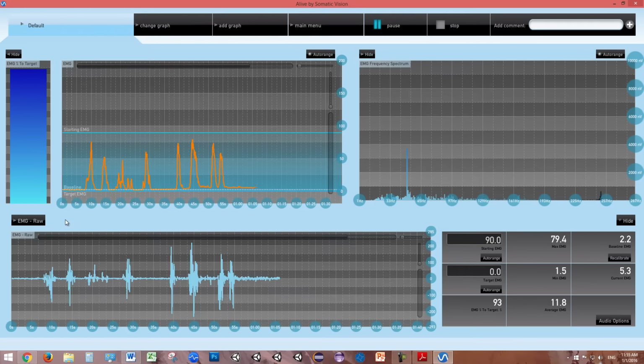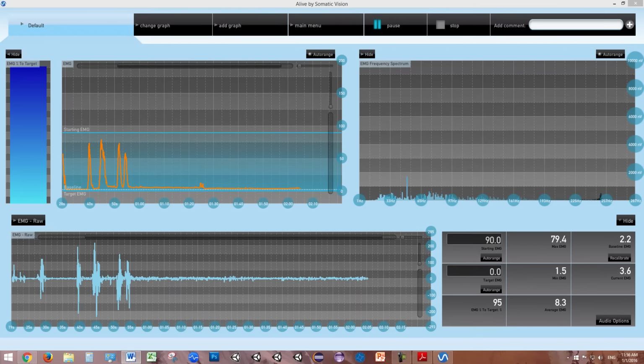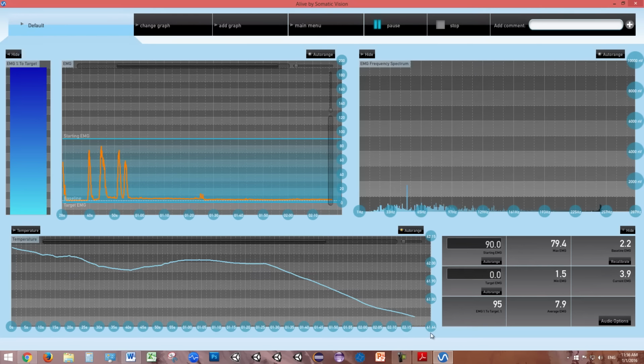In the secondary graph area, you can often change to a different measurement. For example here, the drop-down under EMG raw allows you to select EMG relaxation or tension automatic measurements, temperature, skin conductance, or breath pacer. I've currently put the temperature sensor on my index finger, held in place by the finger sensor already there. So, under EMG raw, I can switch to temperature and see my current finger temperature.